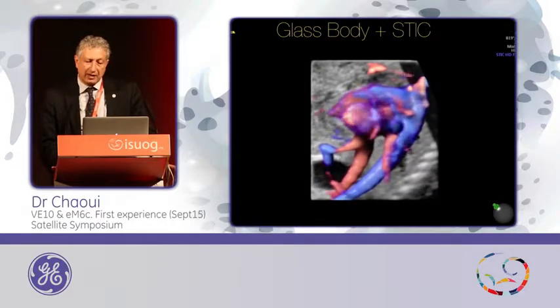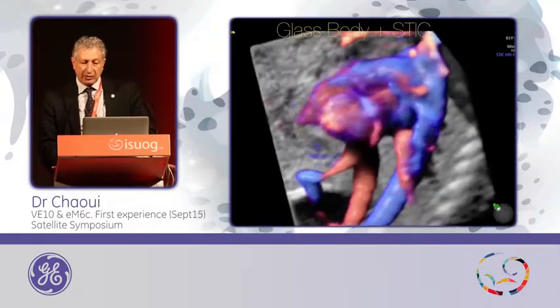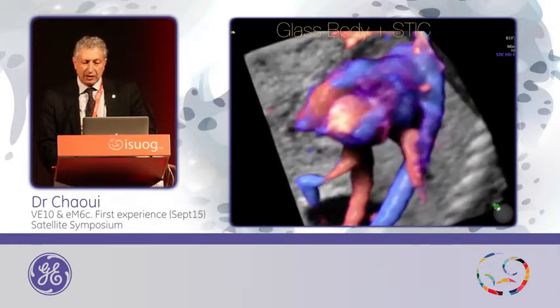You see the pulmonary vein, the descending aorta, the inferior vena cava, the ductus venosus. And this is a projection where you can recognize the relationship of the vessels to each other, and you can rotate the volume and even change the direction of light.